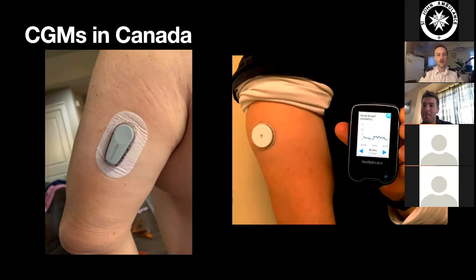And so these are, again, there are some other medical devices that attach to the body and look similar. But when you're dealing with an undifferentiated patient with an altered level of consciousness, if as part of your rapid body survey you come across something like this, it's going to be a strong indicator that you should be considering diabetes as part of your differential.